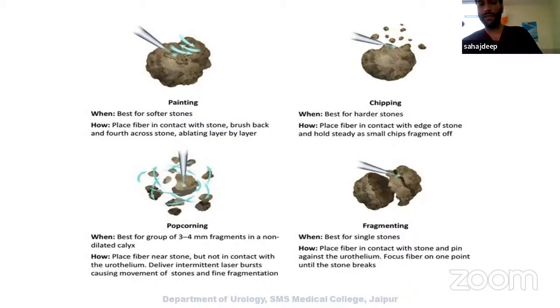Painting is best suited for softer stone. In this technique, we move the laser fiber tip back and forth in a medial-lateral or lateral-medial direction until a fine dust is achieved. It is more suitable for the soft stone.